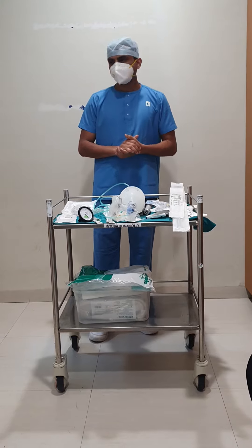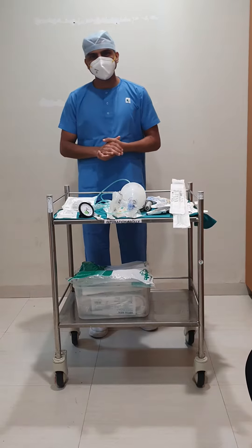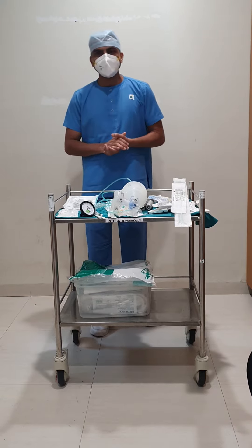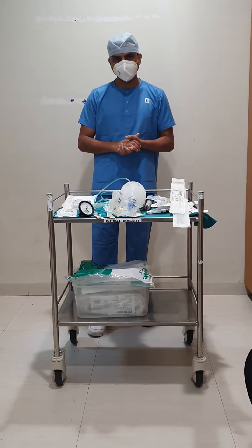I am Ajith Sarasya, ICU nurse coordinator, and I will be explaining about the articles and equipment needed for an intubation. Intubation is a procedure where you will insert a tube through the trachea for providing artificial ventilation.